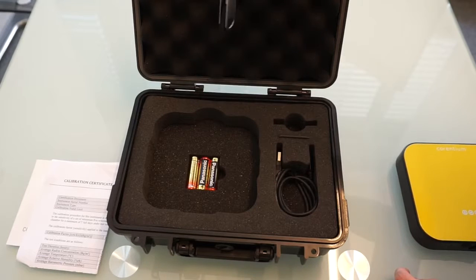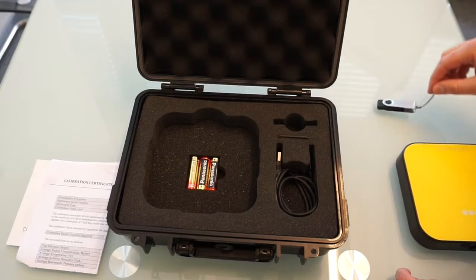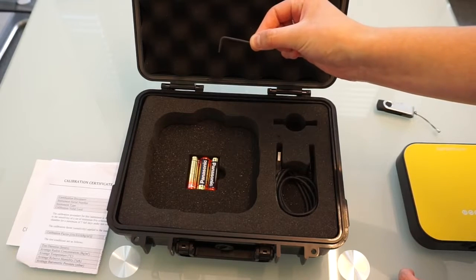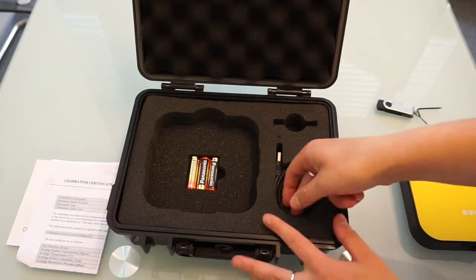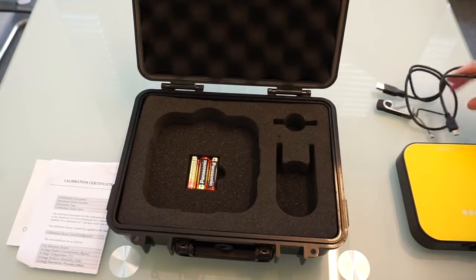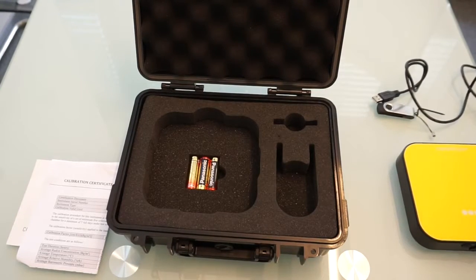Here you find the USB drive with installation file for reporting and analysis software, a screwdriver to use when you need to open the battery slot, and the USB cable to connect the device to your computer. On the device there is a power on, monitor restart button.